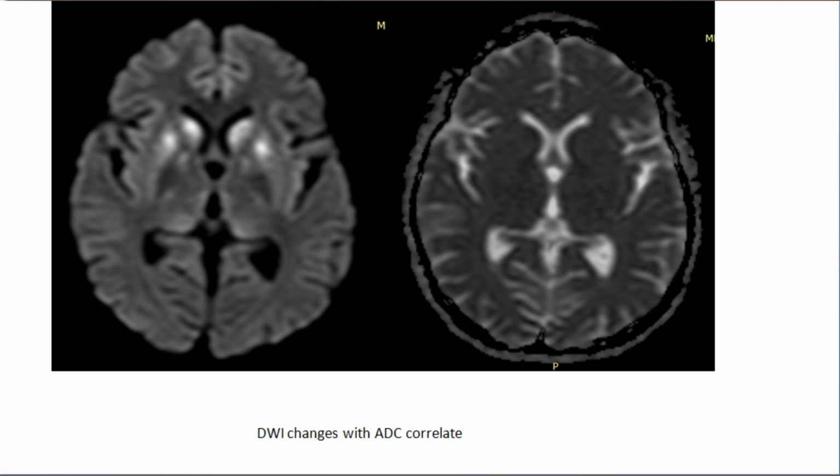So what do you see here? Let's skip the sequences because it's taking a little longer. So let me know the abnormality. But it is DWI, I mean, you guys can read. Okay, so what's going on over here? You can just say there are hyperintensities in the head of caudate and globus pallidus. What else? Is it an ADC map? It may not be very clear, but not a typical one, you don't see clear hypodensity there. What did this patient have?